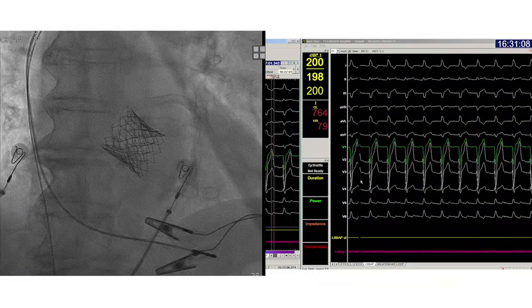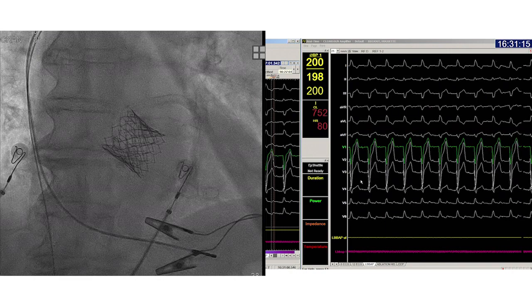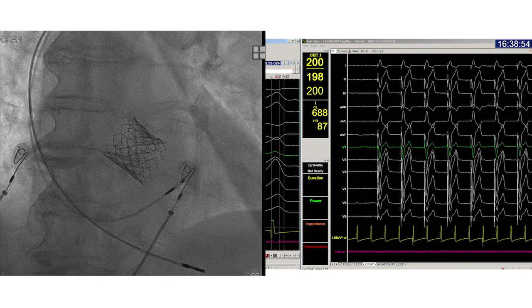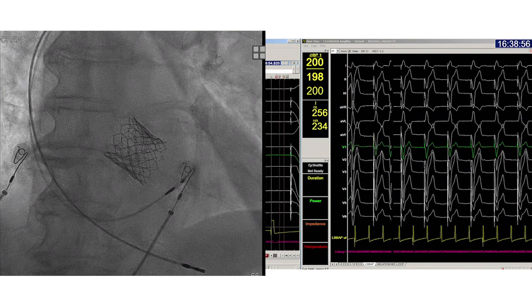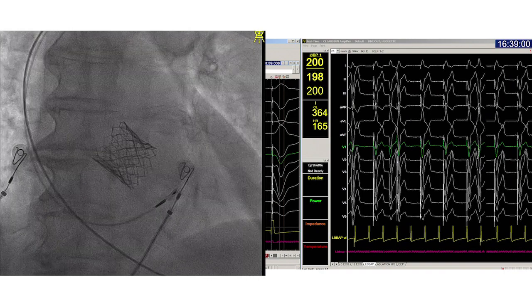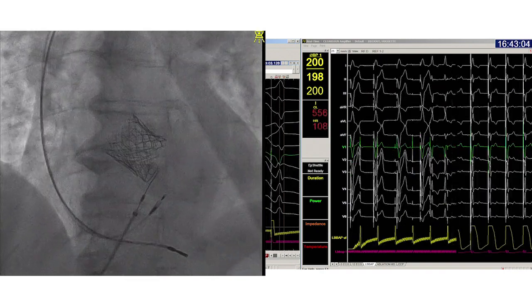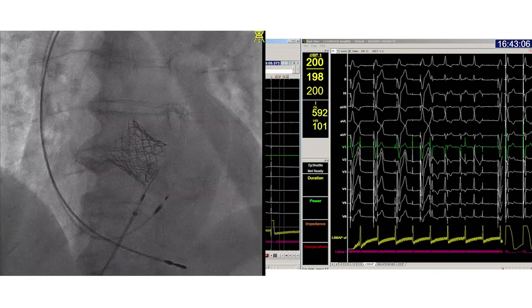In this second case with conduction disease after a TAVI procedure, some other features will be shown. Since the patient has LBBB and the guiding catheter can bump into the RV and create AV block, the atrial lead is temporarily placed in the RV to enable RV backup pacing. The guiding catheter is again placed high on the septum — now closely watch the ECG.